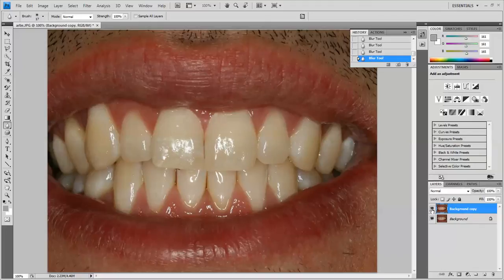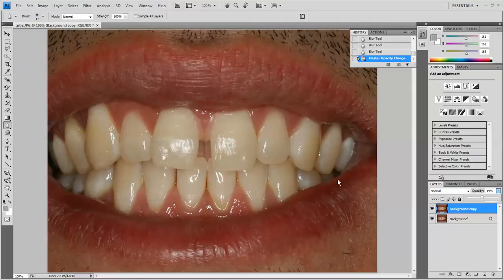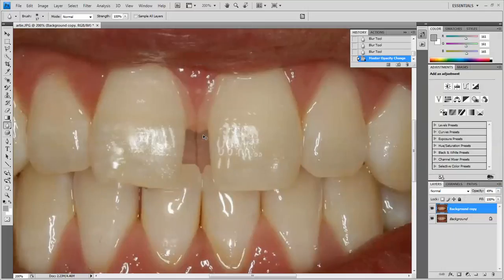This is helpful to look at and say, is this going to be too wide for this patient? Can we even accomplish it? Are they going to look like they've got rabbit teeth? My favorite feature of this is I can come into this layer and turn the opacity down to about 50%. Now this photo becomes really, really valuable because you can see the ghost image of what we just did — our simulation superimposed onto the original teeth. One thing that jumps out to me is that while the teeth look really nice, can I actually squeeze that papilla as much as I'm seeing right here? If I zoom in, you can see I've really squeezed this papilla and I might not be able to accomplish that without some crown lengthening. Especially if you're adding length to a tooth, this kind of picture becomes really valuable so that you can do lab communication and really see where you need to add tooth to get the results that you're after.